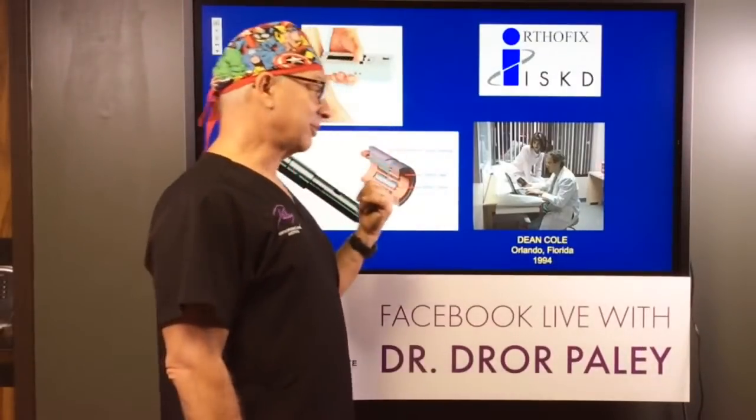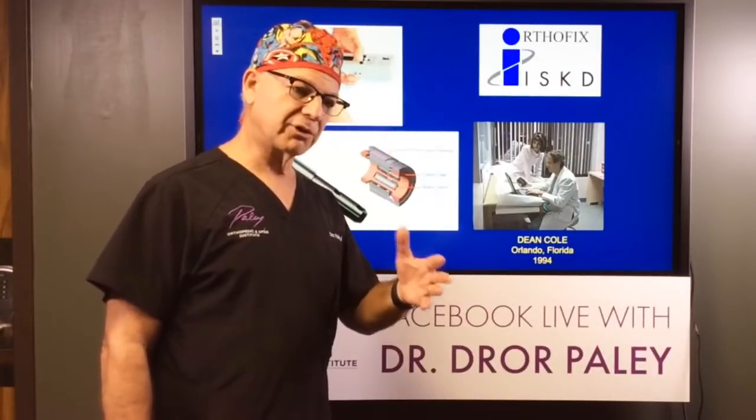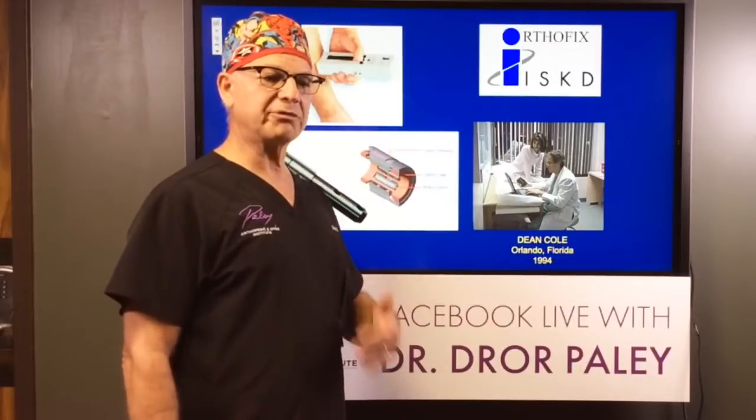So the next device was a company called Ellipse and a colleague of mine, Stuart Green, who developed what was called the Precise Nail. And I had the privilege of putting in the first Precise Nail on December 1st, 2011. And so this device was magnetically controlled. We had an external magnet from the outside, and it would spin around. It would grab the magnetic field of a little device inside the rod, and it would cause it to telescope. It could go forward and backwards. First implantable device that can go both directions. So this was like a next generation device after the ISKD.